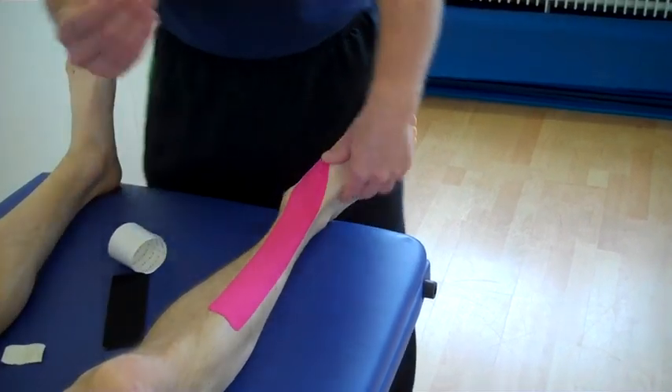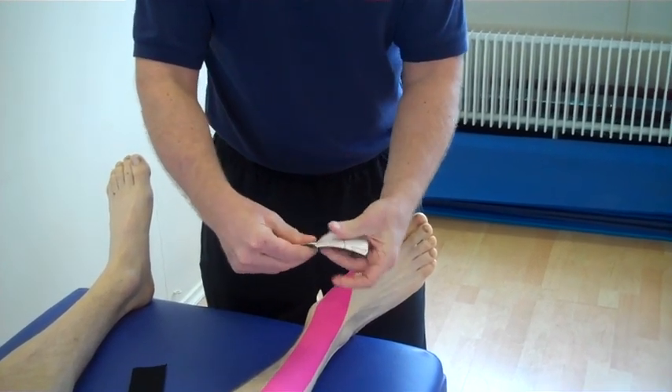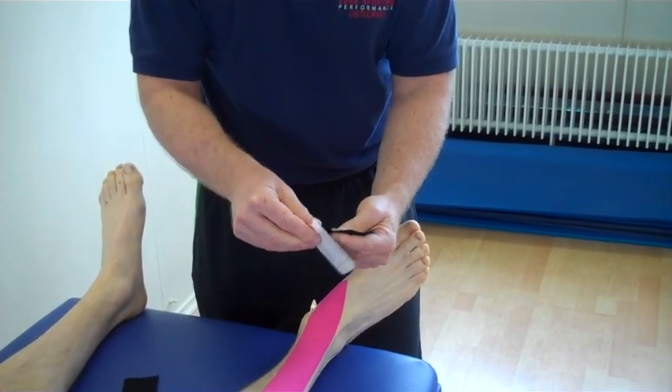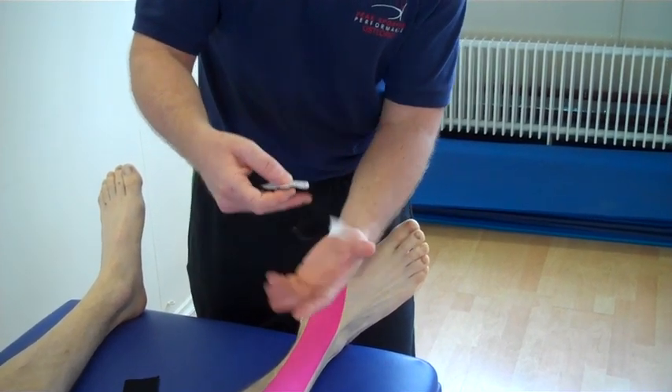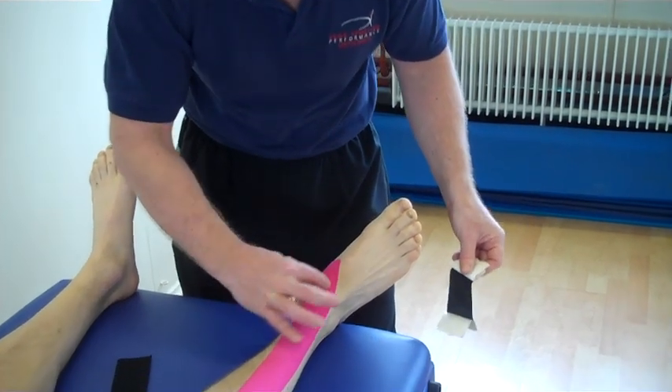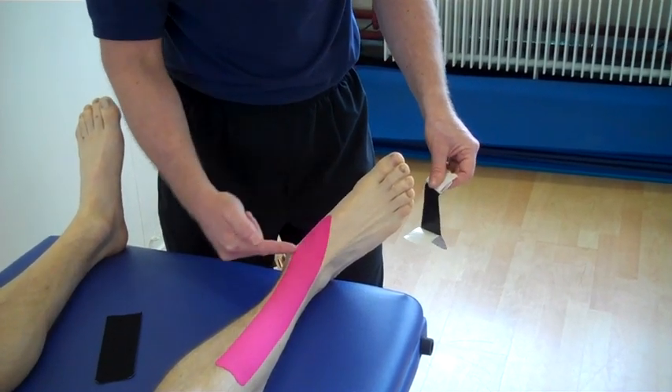We can just literally warm up the muscle and the tape together so it makes the tape a bit more adhesive. Using the two smaller eye strips, split in the middle, literally peel back and hold on. What we can do now is where the pain is located around the tendon side here, we can almost do like an X strip across.